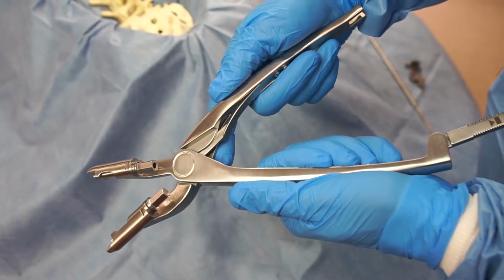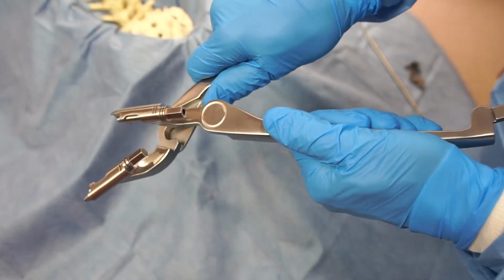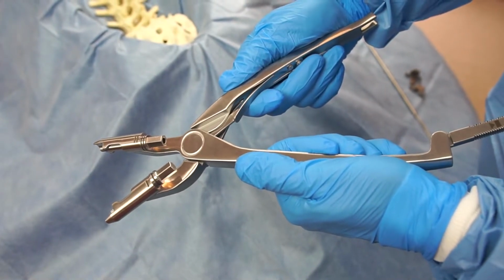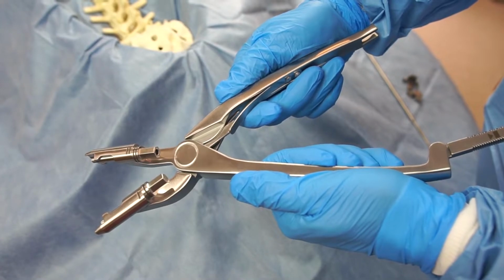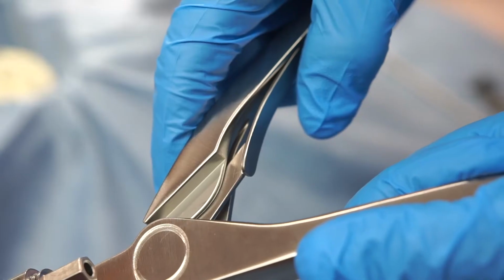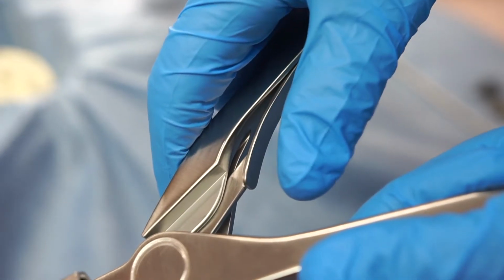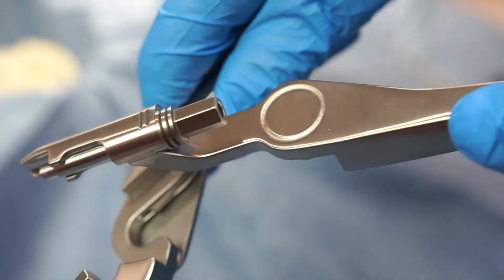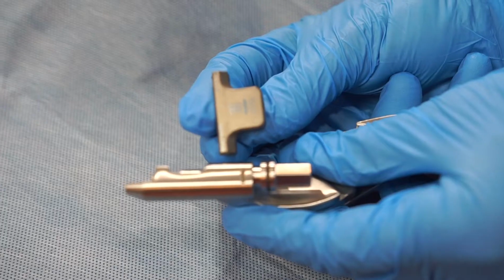The patented precision-guided PG inserter compressor is a separable instrument. In order to implant the Stabilink construct separately, for example, one piece at a time, the instrument should be disengaged. To disengage the arms, press down on the thumb lever above the circular pivot joint and separate the arms. The arms will disengage and separate.